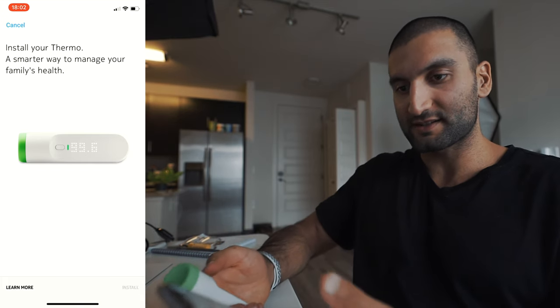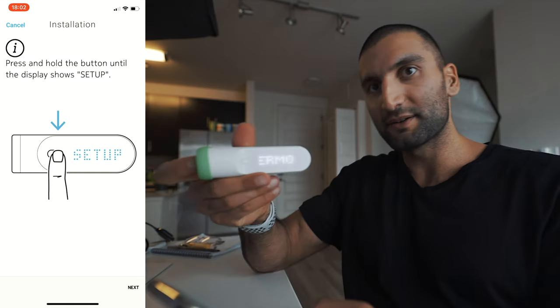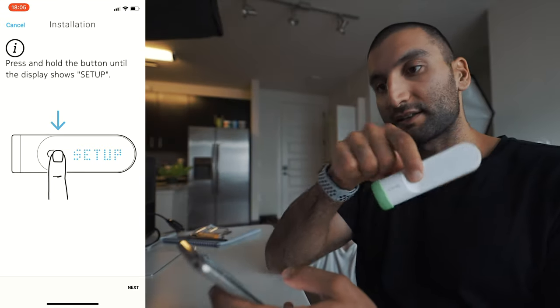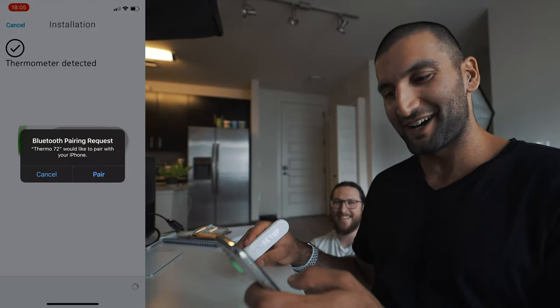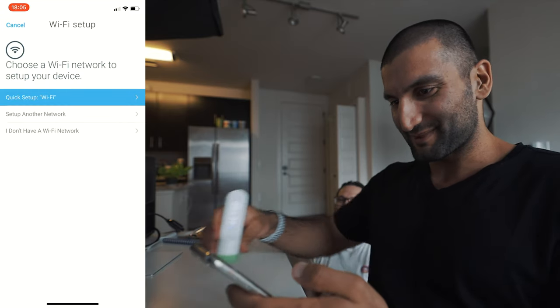Install your Thermo — smarter way to manage your family's health. Let's install. Press and hold the setup button. It's doing something. It says press and hold until the display shows setup. There we go — setup. It just takes forever. Impatient millennial over here.